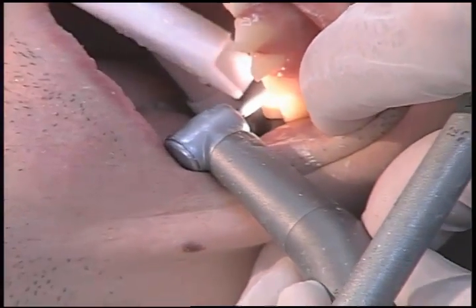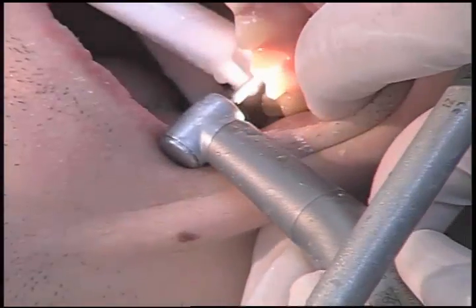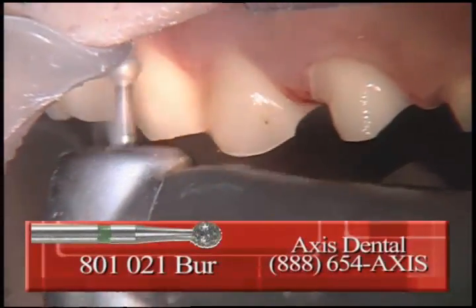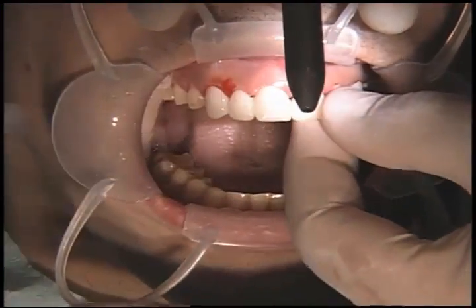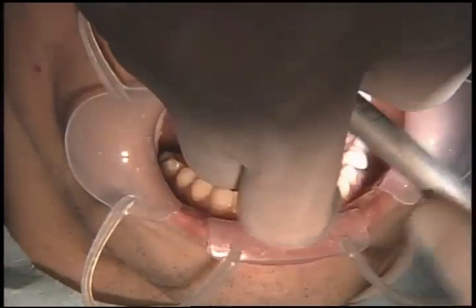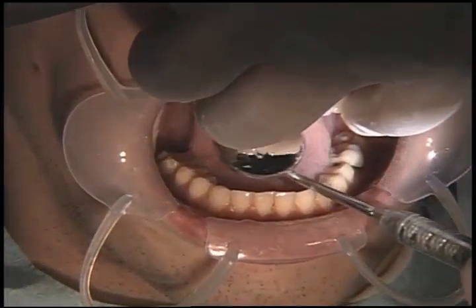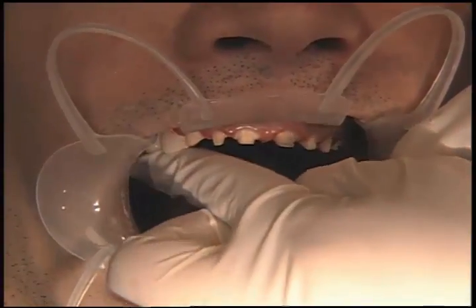On a tooth like this where we still have some features, we can go ahead and use our reverse prep technique by starting with the gingival depth cut with the round burr. Once we've rough-prepped these teeth, we're just going to try on the biotemps on the anterior teeth to see how they fit, and then continue to make any reduction where necessary to get the biotemps to seat passively. You can either look at the biotemps model where they were constructed, or have a sucked-down splint made if you find that to be more helpful.